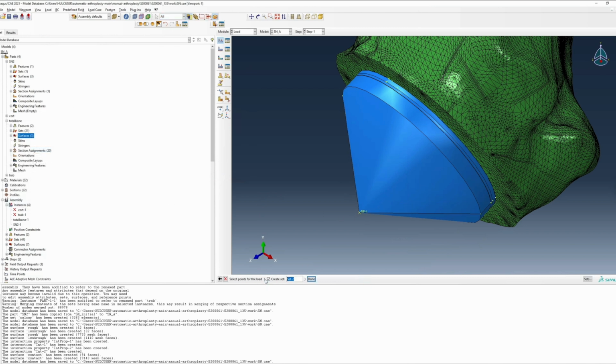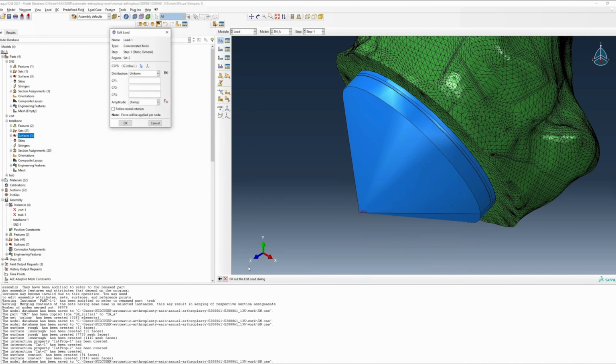As one would expect, the forces applied to your implant will be dependent on your own study. Here, I've used MATLAB to transform instrumented implant data into the vector space of my local CT humeral coordinate system. It's important that you apply this force directly to the reference point, which is now part of the implant geometry.